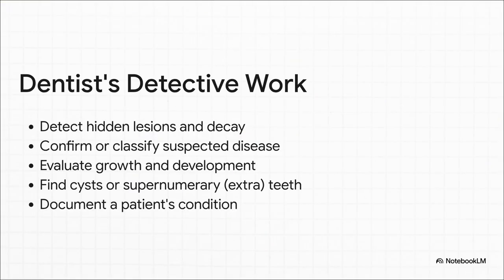Think of your dentist as a detective. Seriously, X-rays are their number one tool for investigating everything that's happening below the surface. They can spot cavities hiding between your teeth, see cysts or even extra teeth buried in your jawbone, and check on how everything's developing long before it becomes a visible problem. Without these pictures, they'd be flying completely blind, and tiny issues could turn into massive problems.